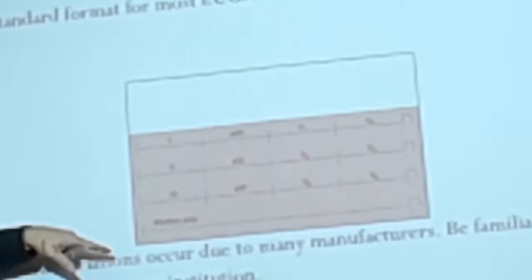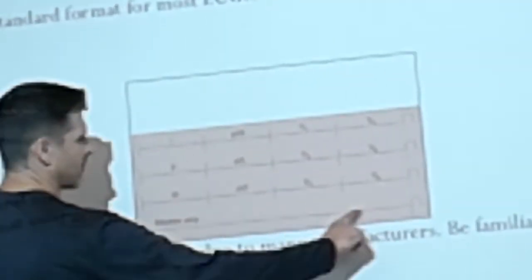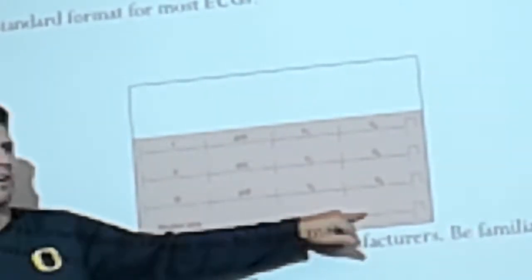Many EKGs would then also give us another strip at the bottom. Depends on how much money you paid for your monitor. Another strip on the bottom that is whatever strip we want it to be. You can make that be whatever one. But the whole strip is the same thing. So a lot of people default to letting it be lead 2. I don't really think lead 2 is necessarily the best one to put there, but it doesn't really matter. They'll just default it to be one strip all the way across. And it just helps us to visually see the field a little bit better. And I'll give examples of that as we go. So they're always lined up in the same way.